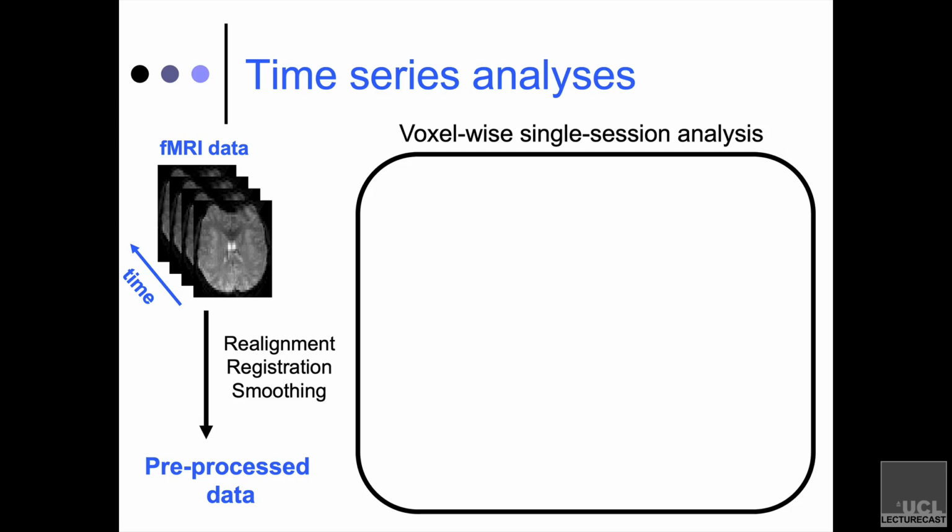And what we're going to do is we're going to take this analysis on a voxel-wise level. That is to say, in the 3D space that we've collected from EPI data that is our brain data, there may be 25,000 individual voxels in there, right? Each one a 3 by 3 by 3 millimeter cube of brain tissue. We're going to analyze each of them individually. And this is that mass univariate approach.